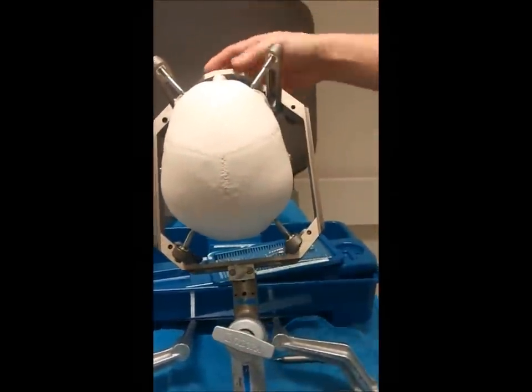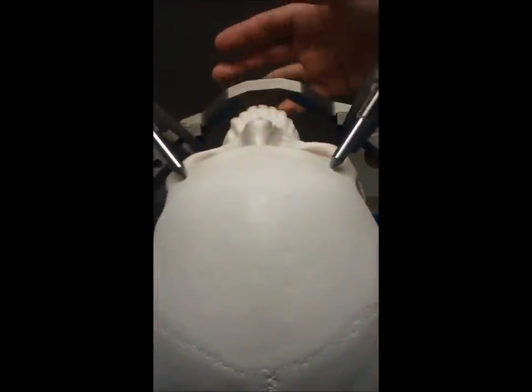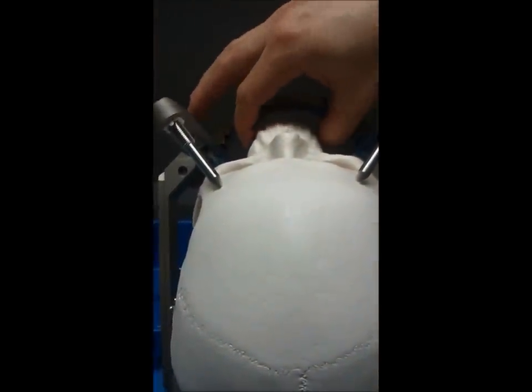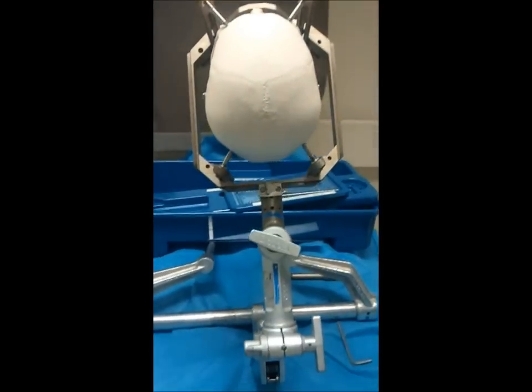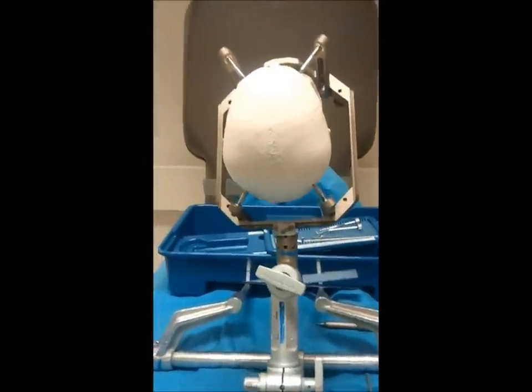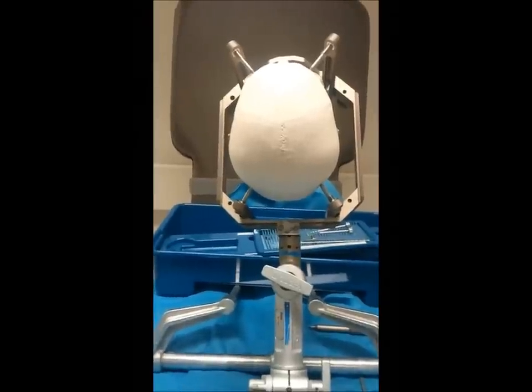That will give us a simulation of what we see when we're working on the patient's head. The frame placement is not optimal for this demonstration. A nasal cannula can be sneaked in underneath, or placed inside the mouth to provide good oxygenation. This portion of the procedure is all done non-sterilely.